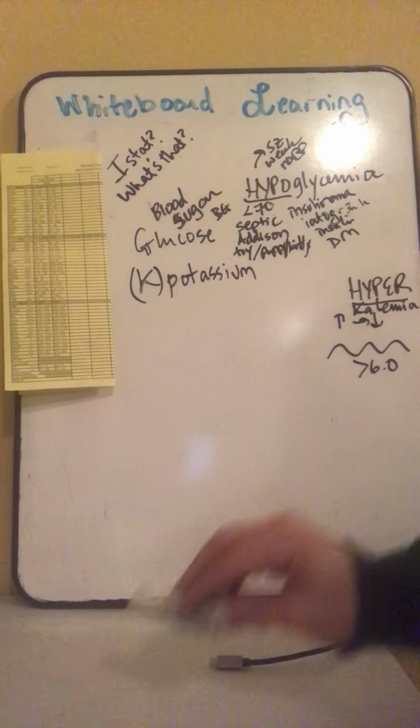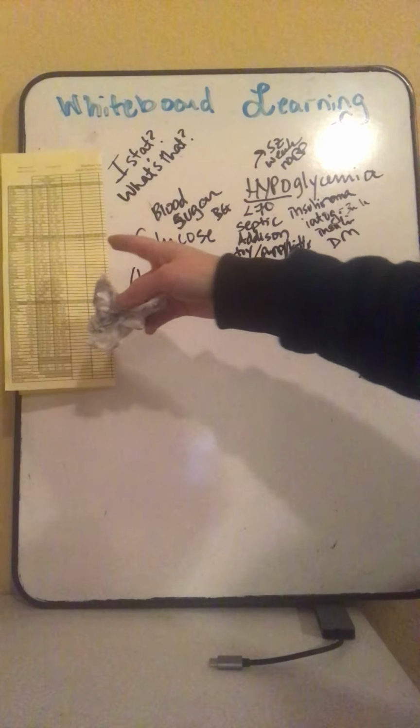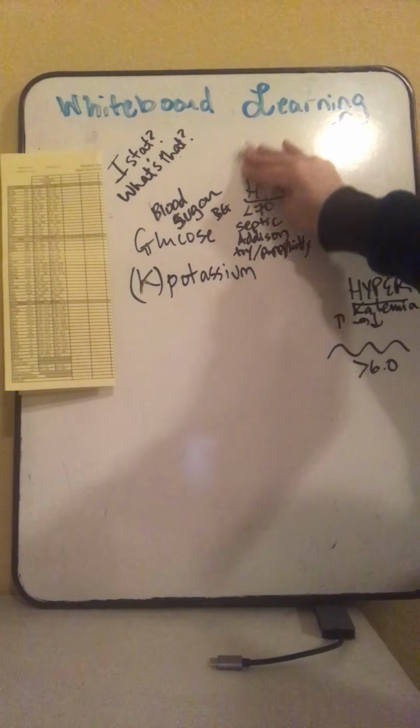And so we would be doing an iStat and then go, uh-oh, the blood sugar's 30, and the doctor needs to know that right away.